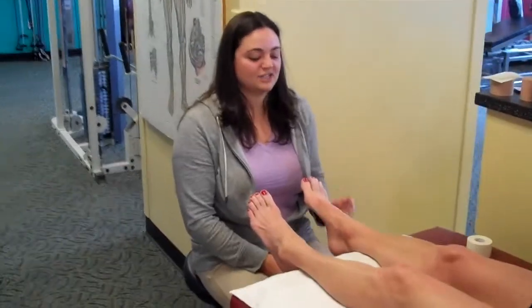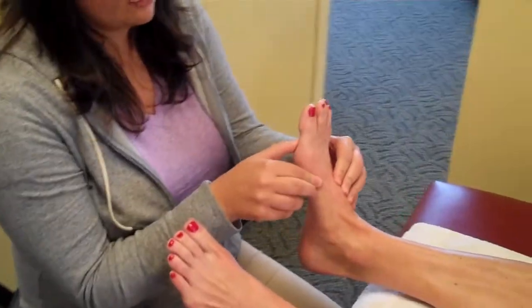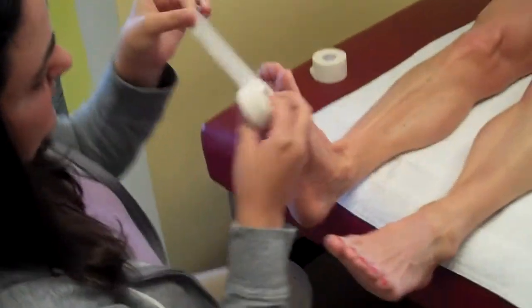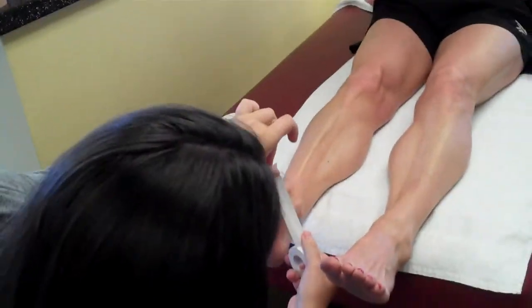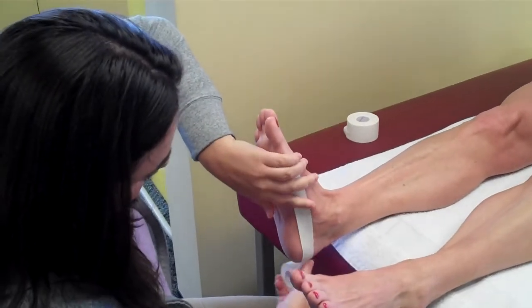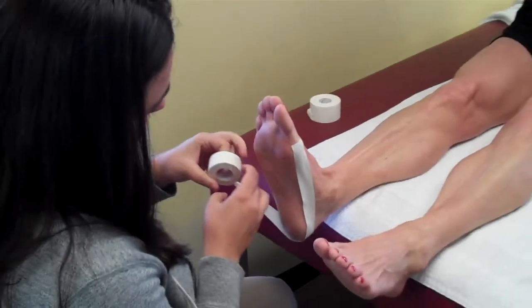So the first technique is what I call teardrop. You want to make sure that your foot is nice and flexed, and I'm going to take a one inch athletic tape and start at the joint here, and go all the way around the foot, and kind of do like a little lacrosse pattern.